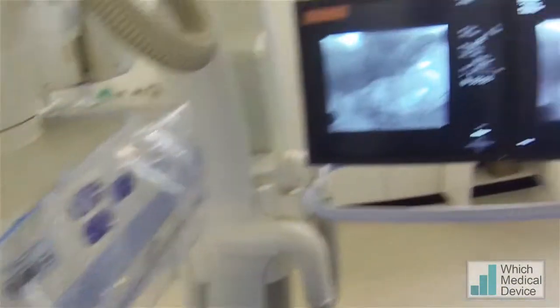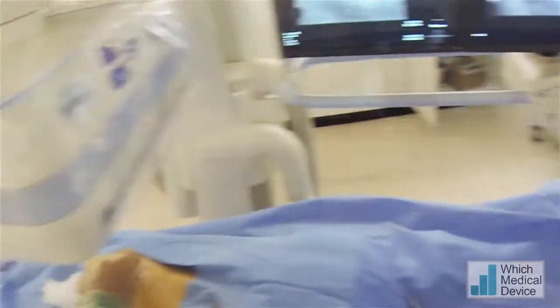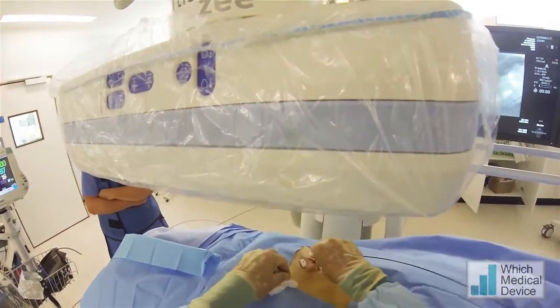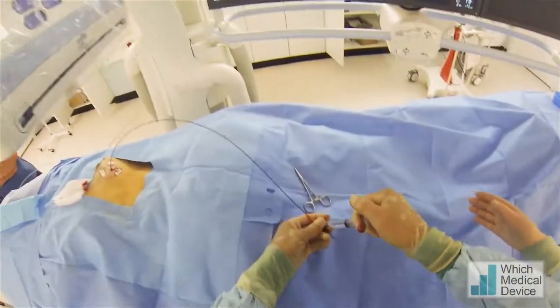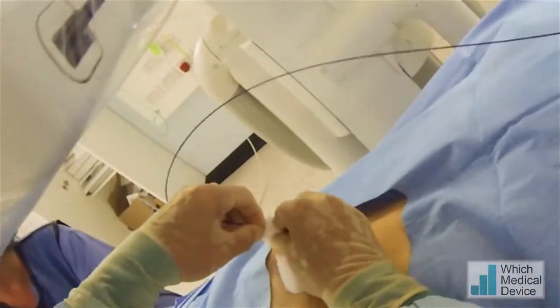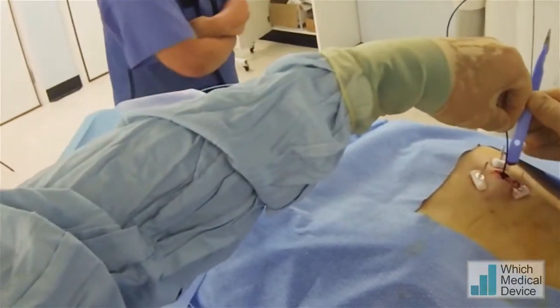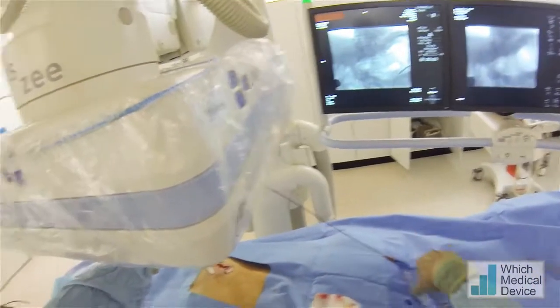We've got plenty of wire in there, angled up towards the fundus — that's fine. Then going to use a 6mm angioplasty balloon to measure the length of the track we're going to need for the gastrostomy. Inflating the balloon and pulling it back to the inside of the gastric mucosa. Measuring from the first marker on the balloon to where my fingers have pinched it at the skin — that's 3cm. So that's a 3cm gastrostomy tube we're going to insert.